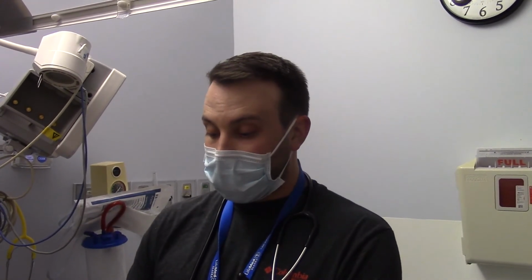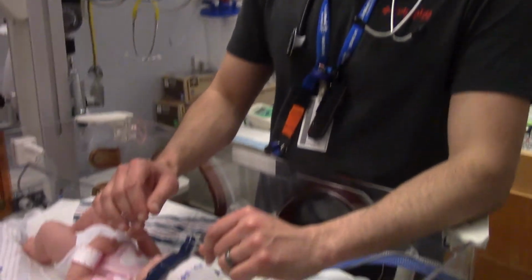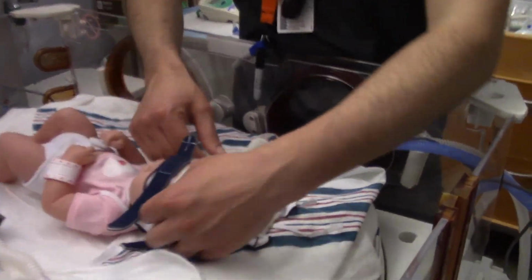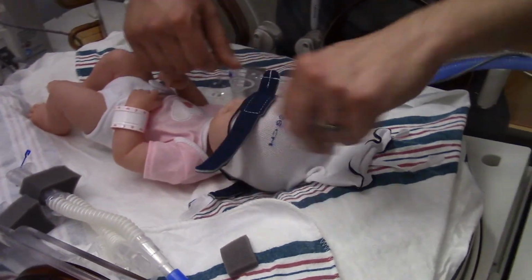Me personally, I like to ask. I like to offer my assistance, holding a hand. If you guys are able to get the bonnet on, sometimes it's easier for a person in a certain position.